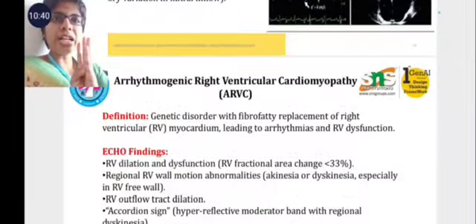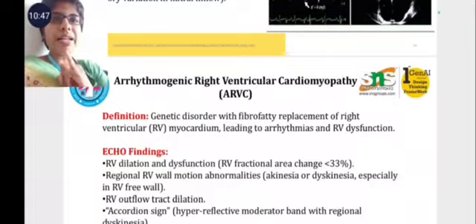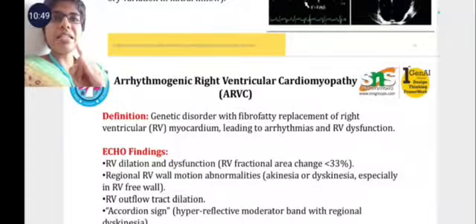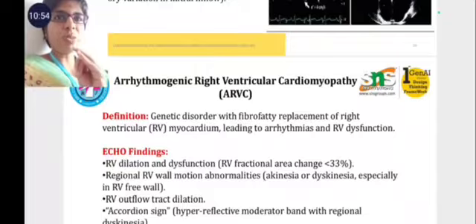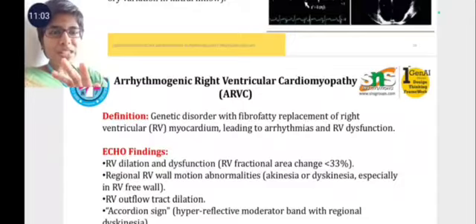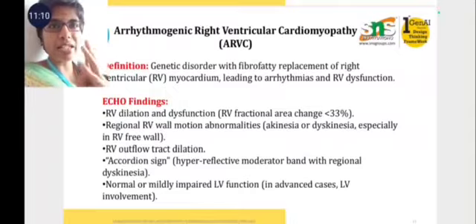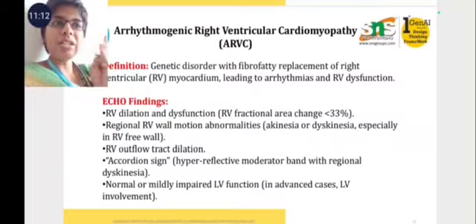And the four conditions are: first is dilated cardiomyopathy, second is obstructive hypertrophic cardiomyopathy, which means asymmetrical septal hypertrophy is also sometimes present. Third one is restrictive cardiomyopathy. Fourth one is arrhythmogenic right ventricular cardiomyopathy. Right ventricle gets impaired, right ventricle gets dilated, and arrhythmia is also present.